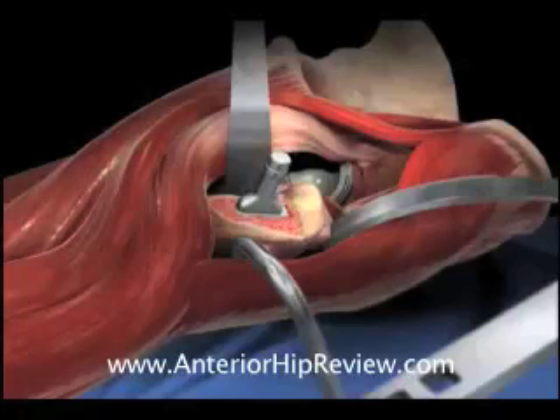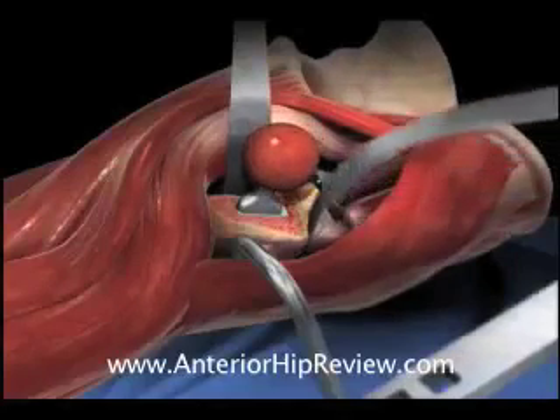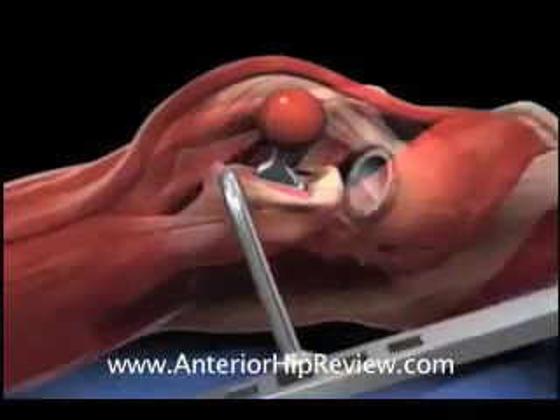At this stage of the operation, when using the direct anterior minimally invasive approach, it is also possible to examine the hip under fluoroscopy to make sure that the limb lengths are appropriately reconstructed, and that the fit of the components within the anatomic landmarks of the acetabulum and the femur is appropriate.